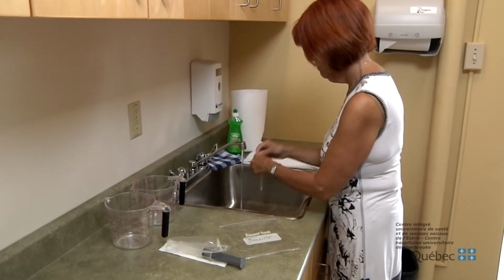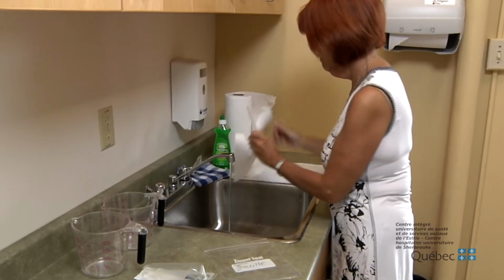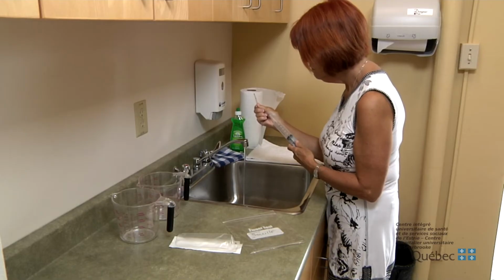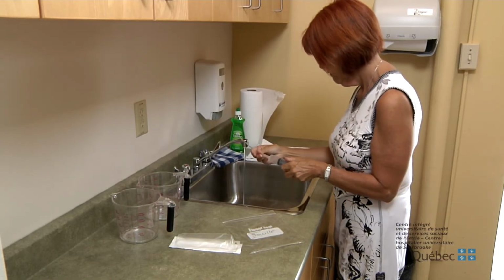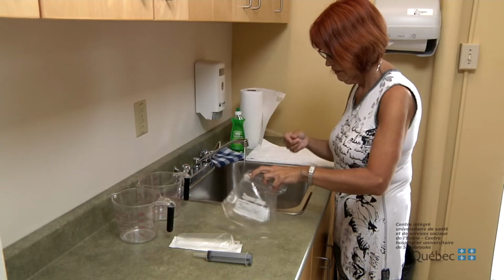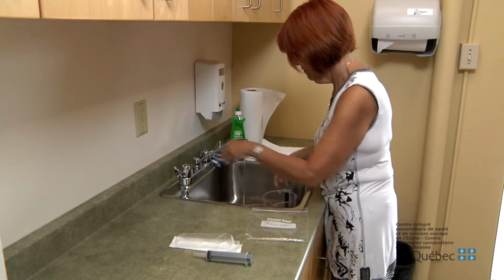First of all, rinse the catheter clean with cold water. Don't let it touch the sink. Dry the outside of the catheter with a clean cloth or paper towel. Use the syringe with a catheter tip to push air through the catheter to dry the inside. Be careful not to touch the rounded end of the catheter. Place the catheter in the plastic storage bag marked soiled. Wash the 2 measuring cups with hot soapy water.